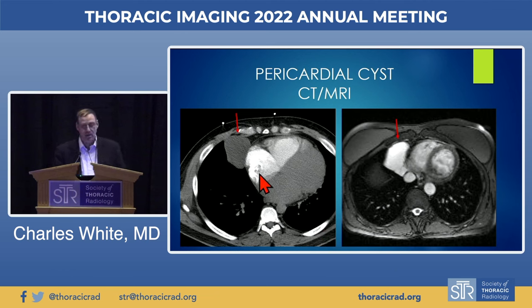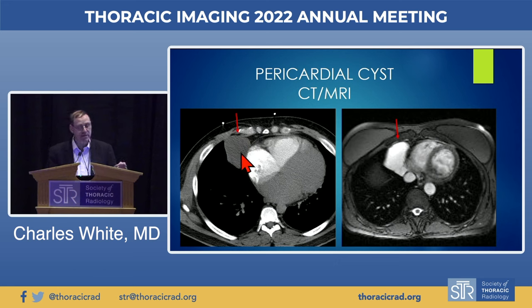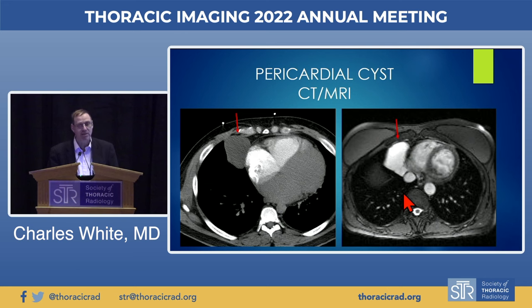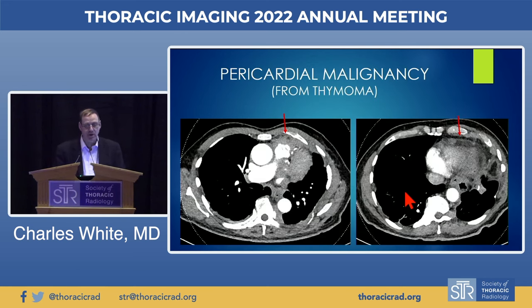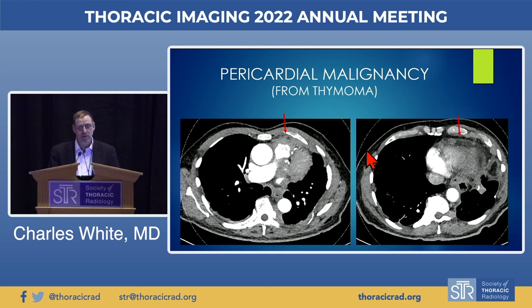A pericardial cyst — sometimes called a spring water cyst — classically has very low density on CT (0–20 Hounsfield units) and appears light-bulb bright on T2-weighted MRI. Pericardial malignancy, by contrast, is very irregular, soft tissue density, and somewhat nodular. In this case, it was a thymoma from the mediastinum that had spread into the pericardium.